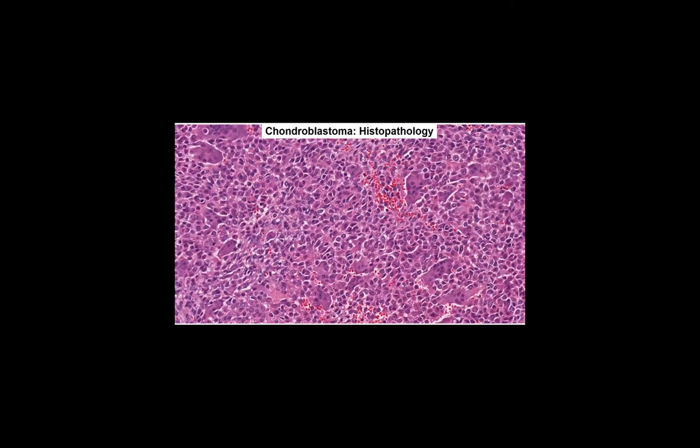Okay, so here is the histology of a chondroblastoma. Again, you can see the background giant cells are pretty evenly spaced, and in the intervening stroma, we're seeing monotonous ovoid cells. It's kind of hard to appreciate on this image, but these cells have characteristic nuclear grooves. Again, it's just hard to appreciate on a static image.